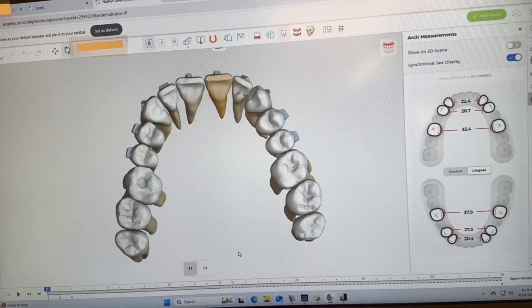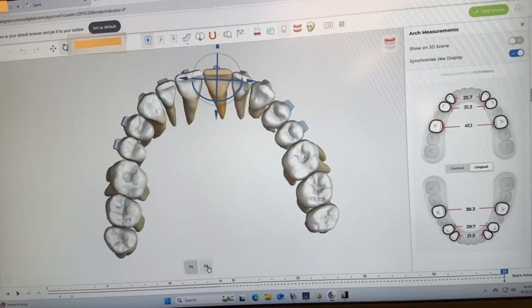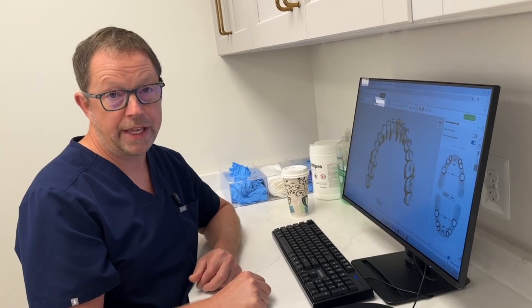Here we are back to the upper jaw — this is the beginning and this is the end. That is quite a lot of expansion. I think his tongue is going to be quite happy in here. This is a really nice case.